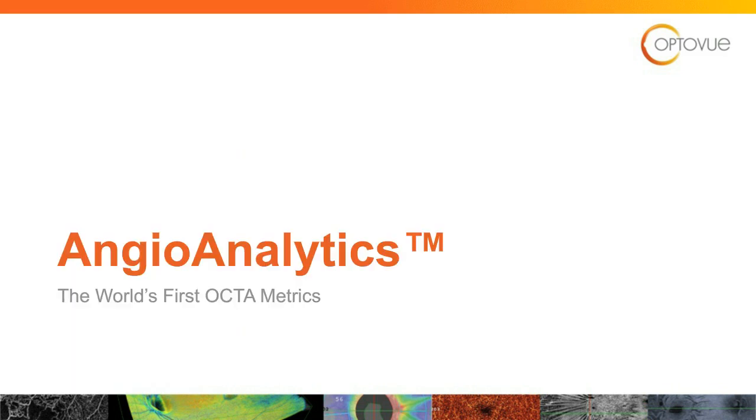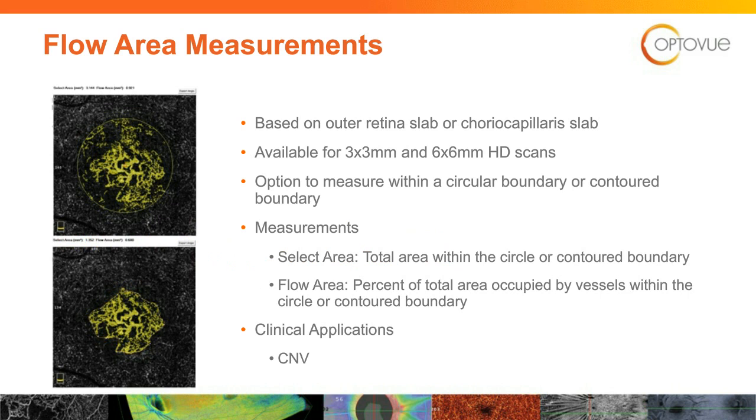It will look at flow, abnormal flow, developing blood vessels that shouldn't be there. The biggest indication here in flow area measurements is in choroidal neovascular membranes. Again, that's a topic for a different webinar, but this is more so the outer retina, looking at blood vessels that shouldn't be there.